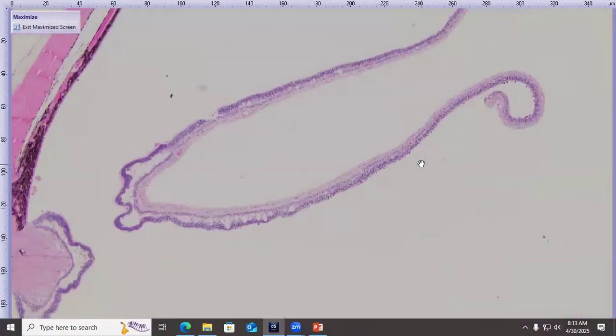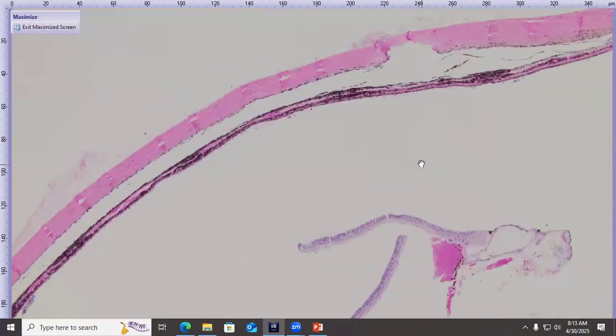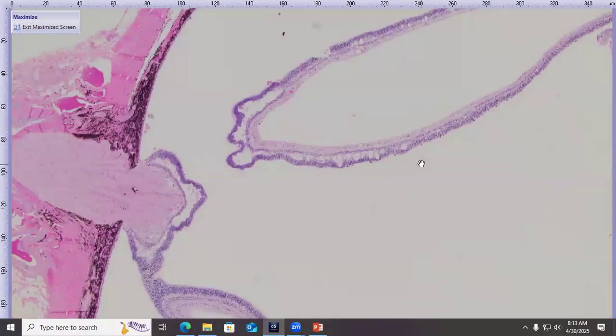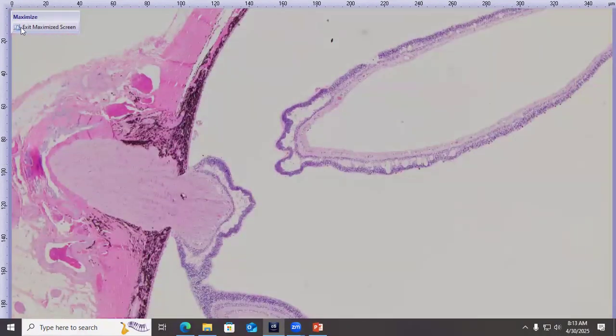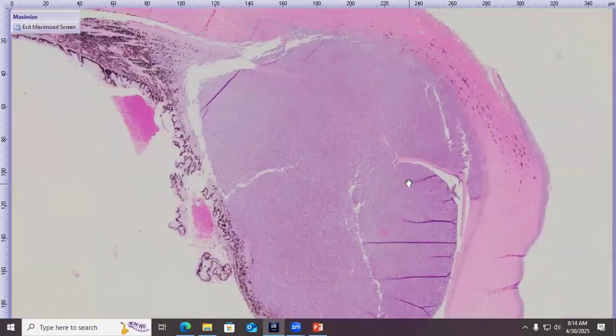We have a lot of retina, actually. Goodness. Don't know what happened there. Yeah, right. Duplicated retina. In our torn retina, we also have these kind of clear spaces within the outer plexiform layer consistent with retinoschisis. And I can also show that a little more closely. But let's start with our masses.